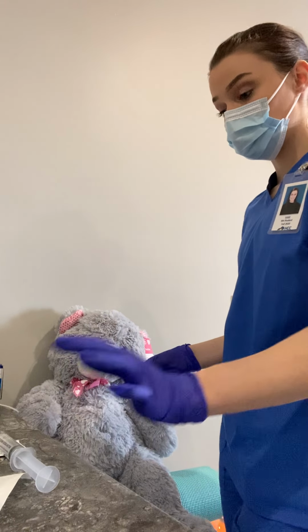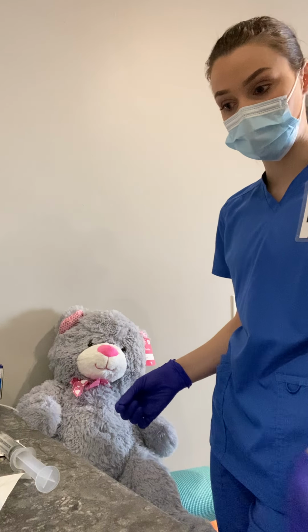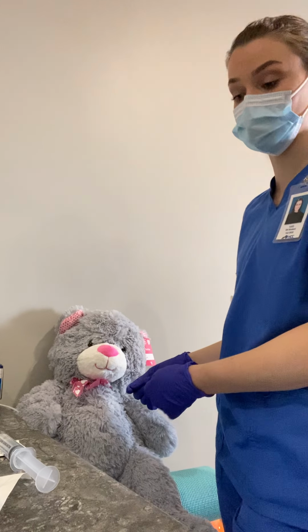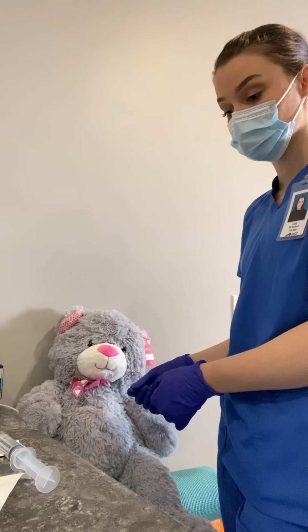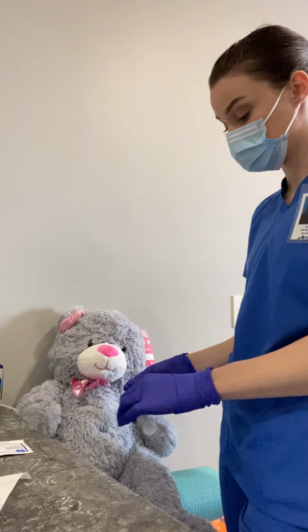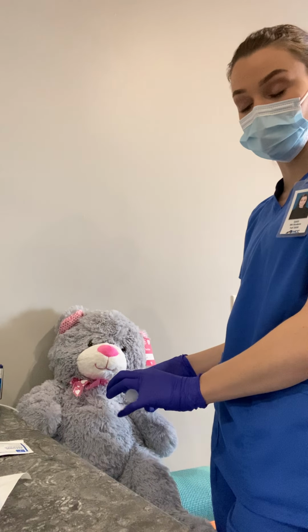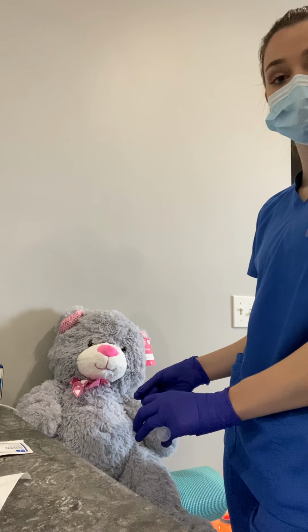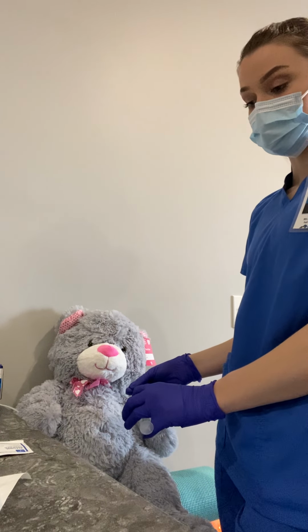Okay, and then she's got another medication. Maybe it's her Lasix, so I'm going to connect that. Flush at the prescribed rate. Disconnect. I've got my normal saline. I'm going to connect. Flush at the prescribed rate. Okay, so then I have that.